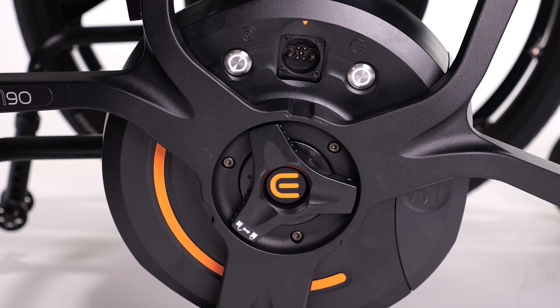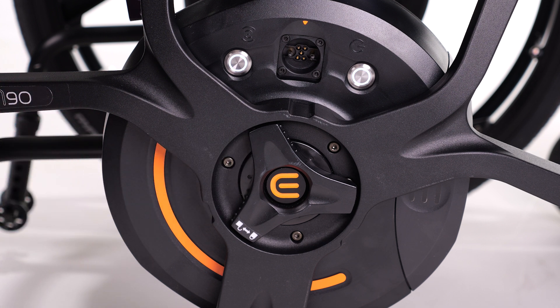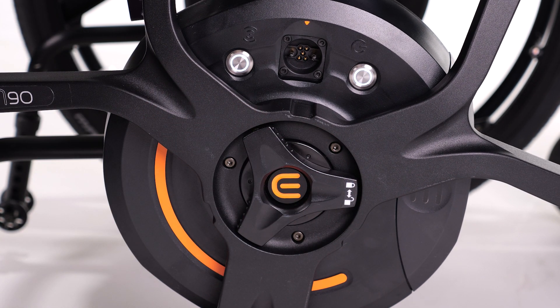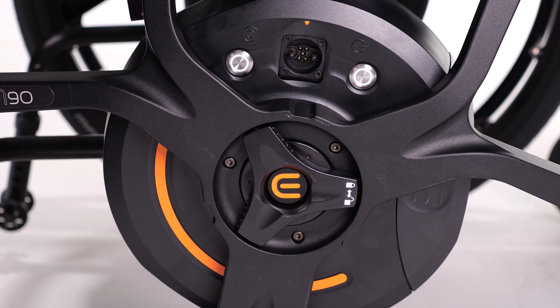The free roll engagement switch is at the center of the M90. It can be rotated to engage or disengage the free roll. There are bumps along the side of the engagement switch. Pushing on the bumps will always engage the drive wheels, while pushing on the smooth side will disengage the drive wheels and enable free roll.